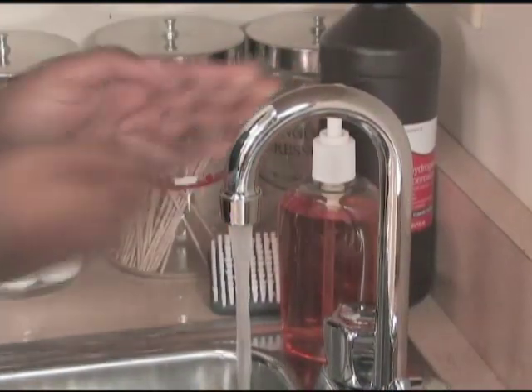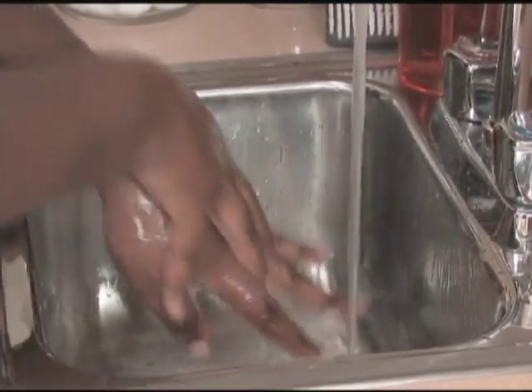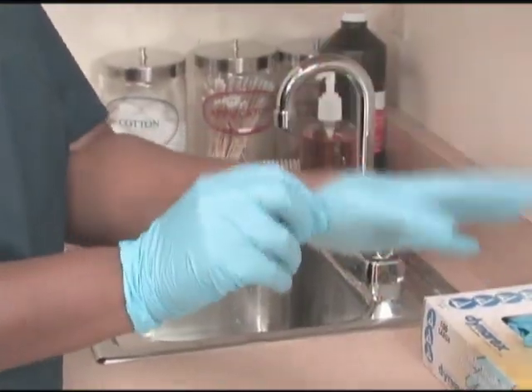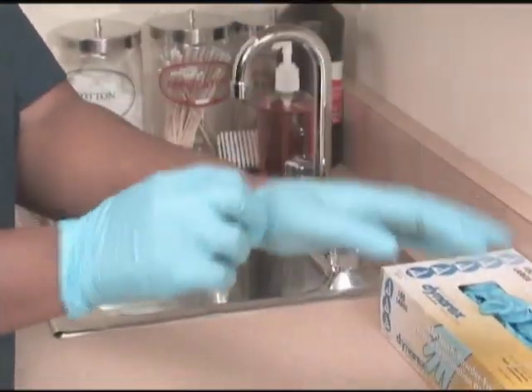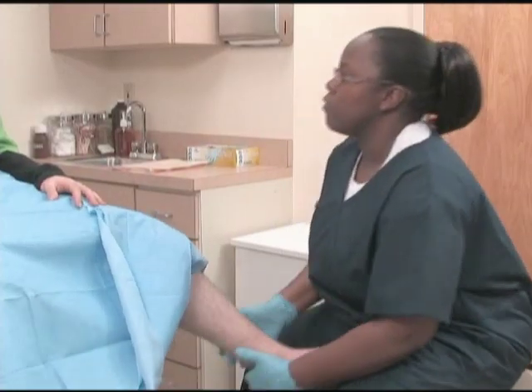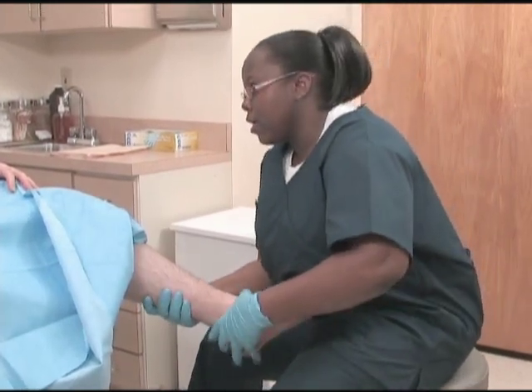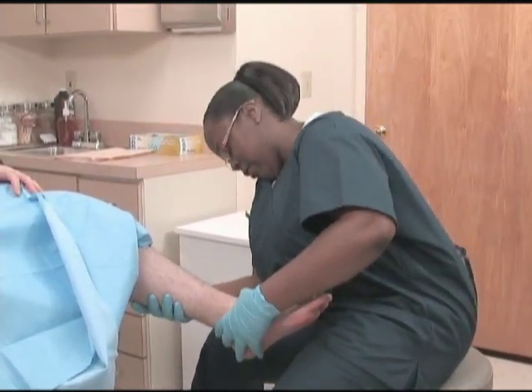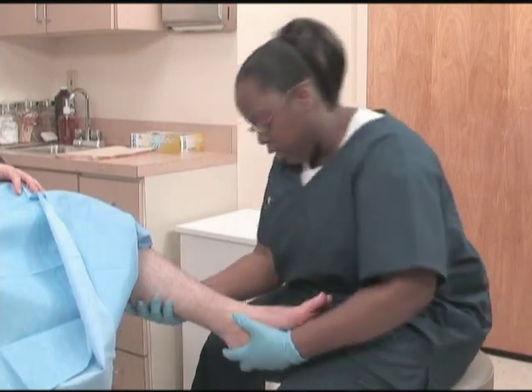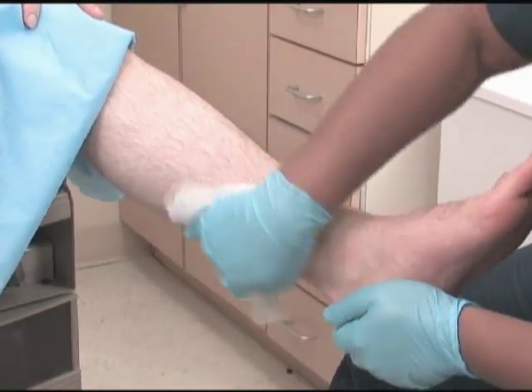Wash your hands and put on gloves. Inspect the area to which the cast will be applied. If there are any open wounds, bruising, or excessive swelling, note these and report them to the physician. After the inspection, cleanse the limb.